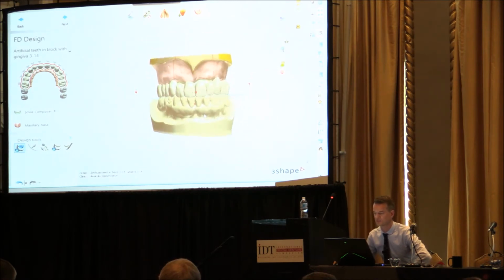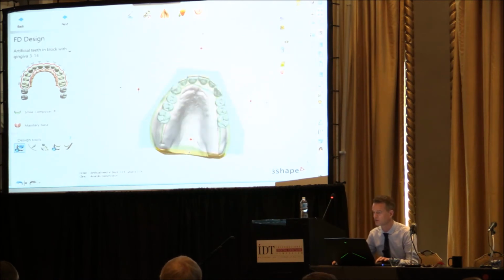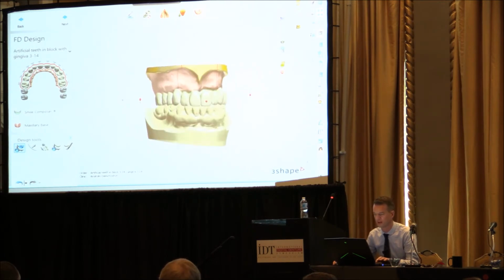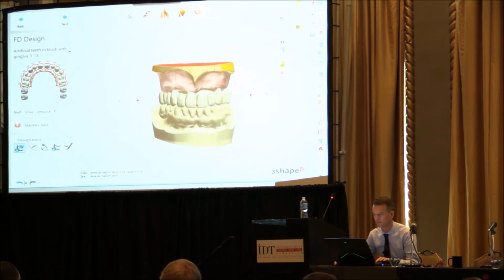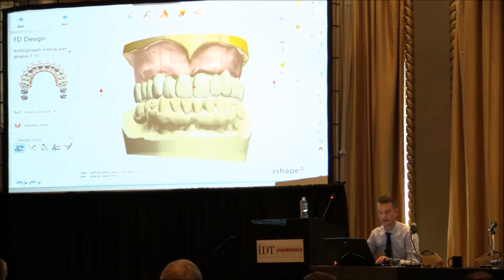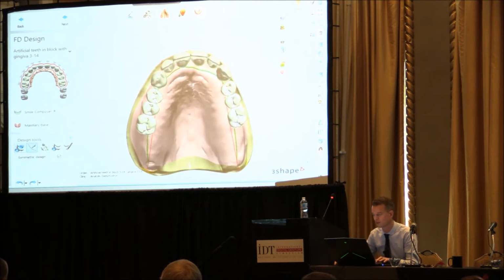So, okay, so let's now try to go and do some modeling here. Just gonna turn off here. So basically you can see now actually it's most impressive if we do this first from the front here. So I have a number of different modeling steps here. I can move my teeth if I want to change the height of my teeth. I can move them up and down. And just grab the whole, so imagine doing this manually, right? I mean, it will take a while. So yeah, I can go here. I can move teeth in groups. So see when I move once here, I also move the other side.